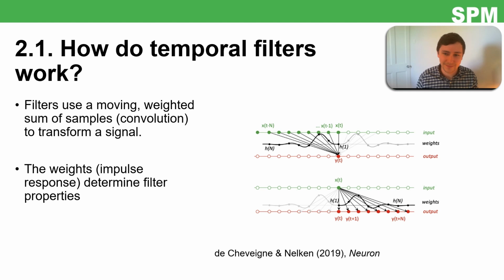They drastically change what you've recorded. And just to say that these weights are essentially the filter design, and they're normally called the impulse response. Briefly, they're called the impulse response because if you were to set your input to be all zeros, 1, an impulse, and then all zeros again, by applying a filter to that impulse, you would then see the weights in the output.